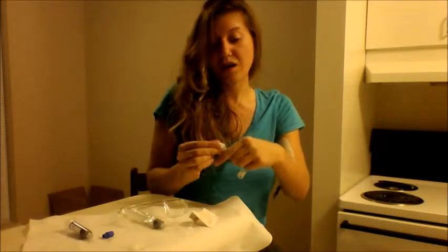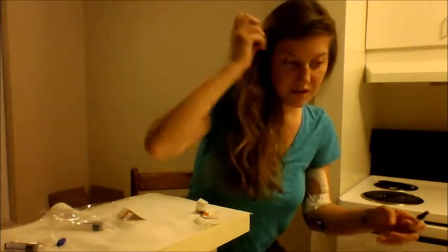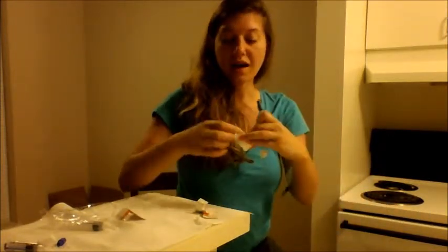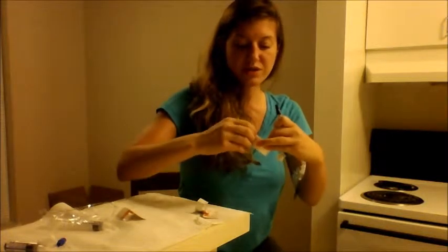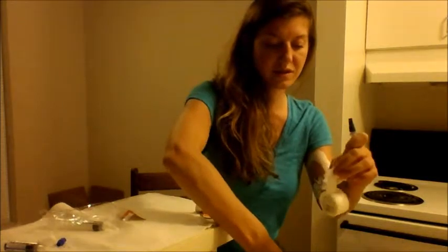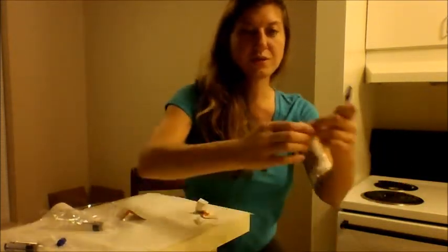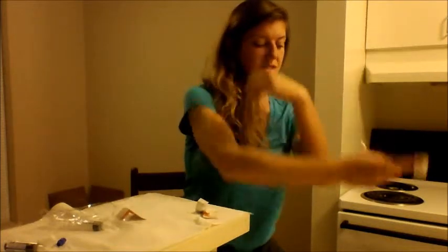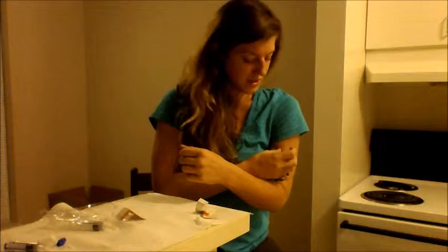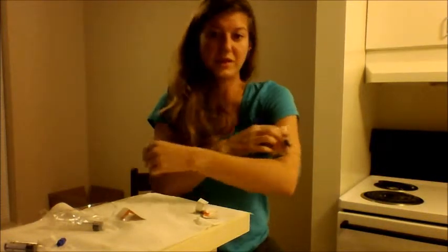And we are done. Let me show you what I do when I'm done — I wipe it with the alcohol swab just to get all the weird stuff off of it. You can use the compression sleeve, but I have a lot of circulation issues, so the compression sleeve actually hurts me — I wake up in pain from it, so I don't do that anymore.